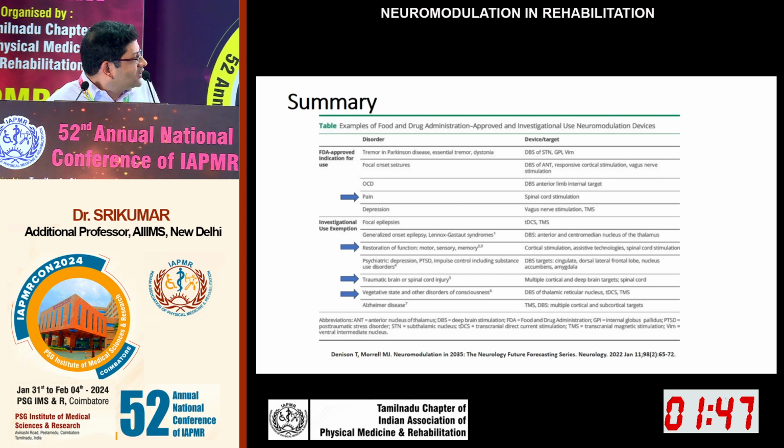And only the epidural spinal cord stimulator is presently approved for use in pain. A lot of research is being done experimentally for the improvement in motor function, sensory, memory function in cases like stroke or traumatic brain injury, and also in disorders of consciousness.